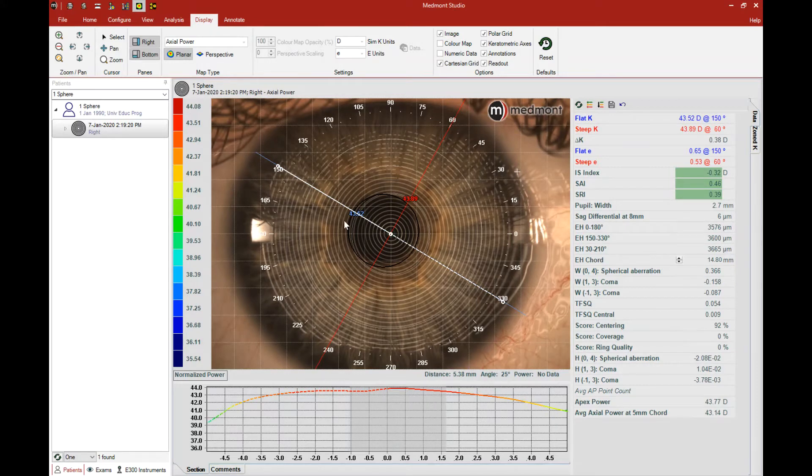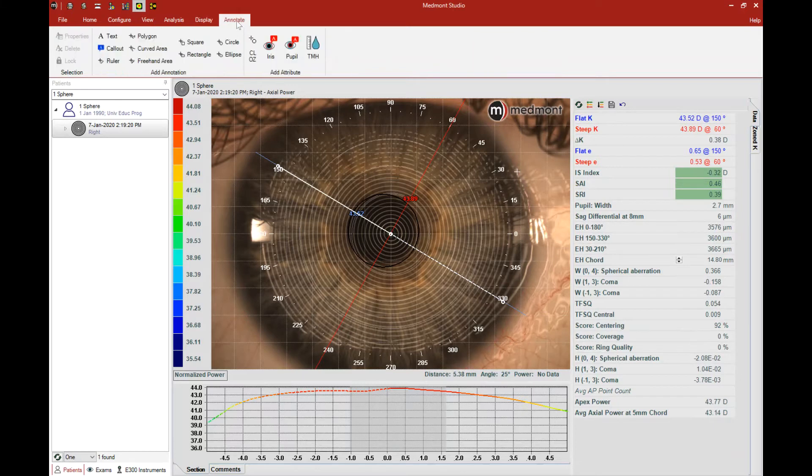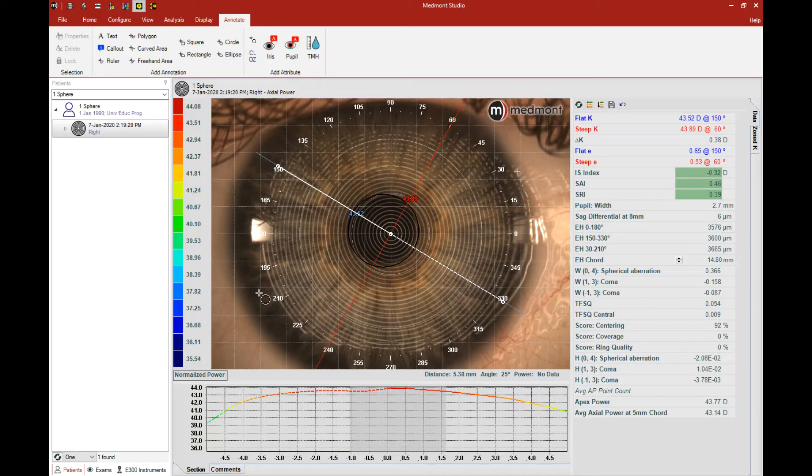The next step is to click on Annotate and then select the Iris Definition tool. That brings up a cross with a circle. Place the cross on the border of the visible iris diameter.